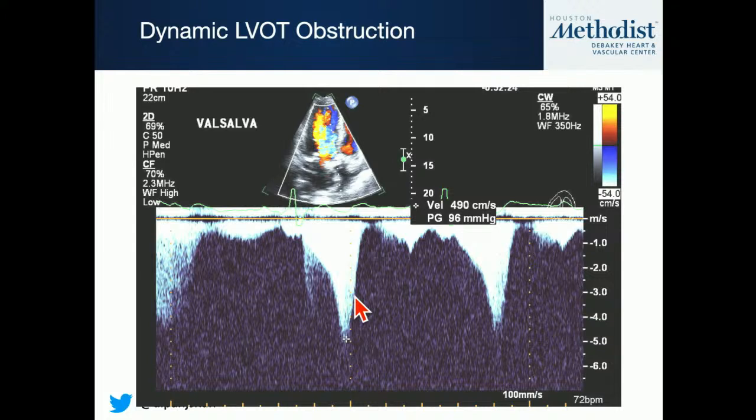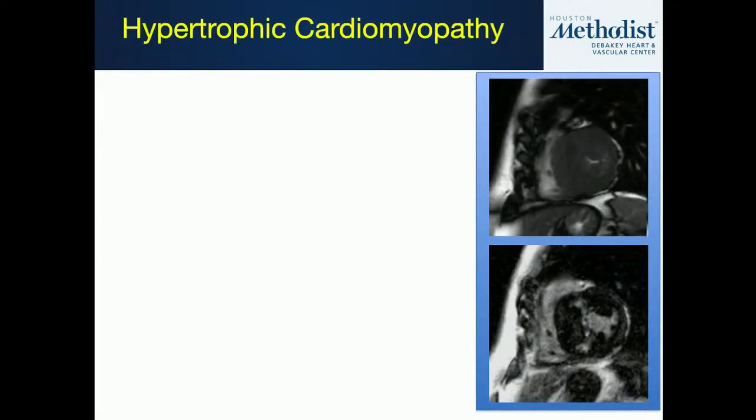Your spectral Doppler here has about 3 millisecond time resolution, while phase contrast MRI is about 30 to 40 milliseconds. So if you get a high velocity in the LVOT on phase contrast MRI, that's consistent with increased velocities, but it's not as sensitive for identifying the true gradient. In those cases, if there's a question of gradient severity, I recommend going on to transthoracic echo.